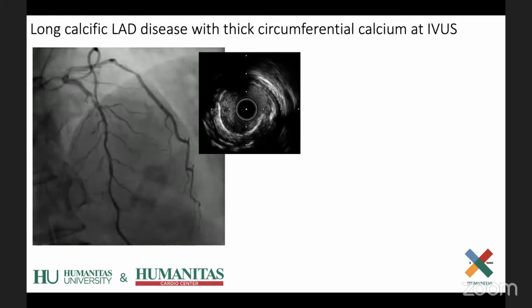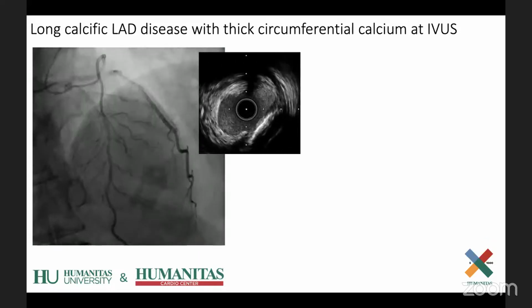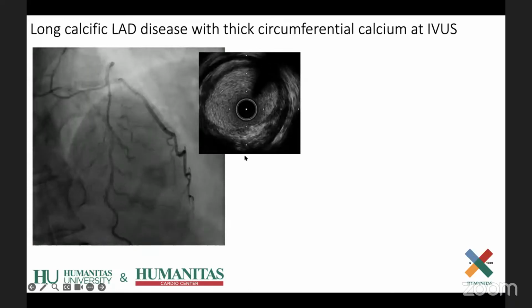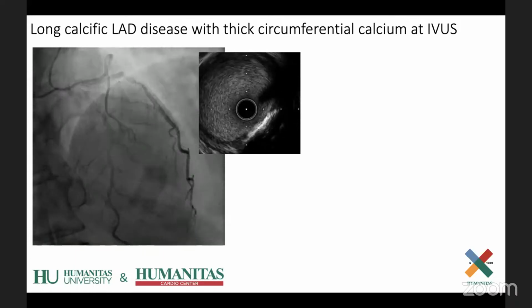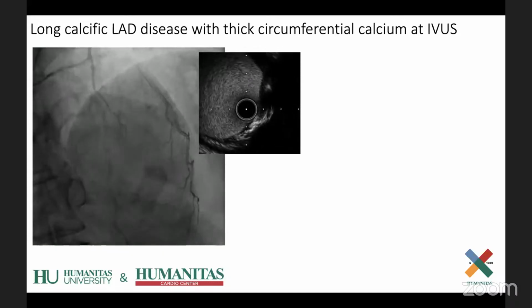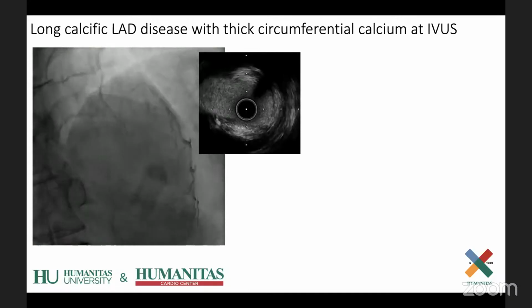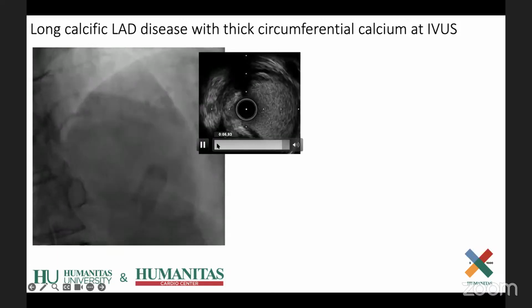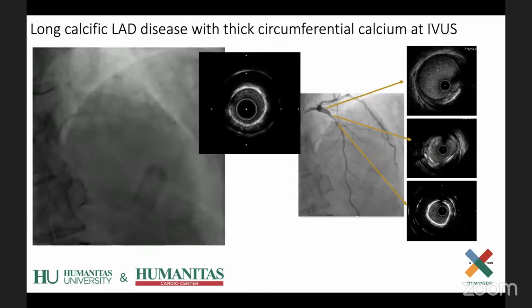Hi, good morning. I am seeing here a very tight lesion, concentric calcium throughout, it is 360. In this case, what I would probably do, by habit, is use a rotablator. I don't think lithotripsy would work; I would have to struggle to get lithotripsy through it. So that would be my first choice in this case.